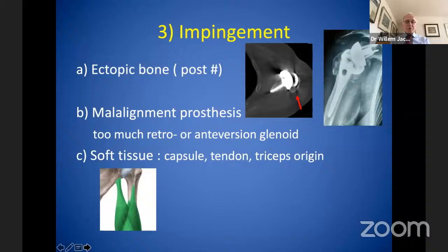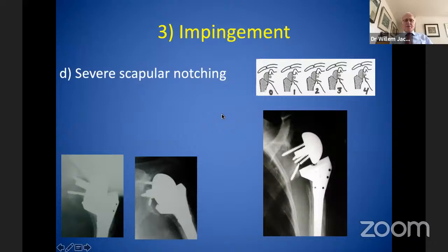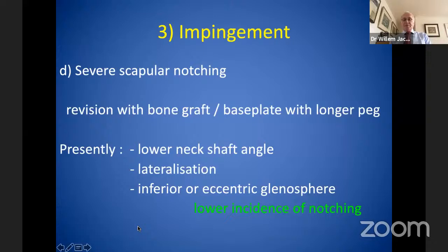Well, the fourth, of course the most frequent, is scapular notching. Grades 0, 1, and 2 hardly ever cause instability, but type 3 and type 4 can lead to severe notching like here, breakage of the screw, and impending instability. And then there's another case where there is a dislocation due to breakout due to this very severe notching inferiorly. That is an older Grammont type where we didn't pay that much attention to the inferior or eccentric placement. So generally you have to revise the glenoid with a bone graft or a base plate with a longer peg. But presently there's a lower incidence of notching thanks to the lower neck shaft angle, the lateralization, and the inferior or eccentric glenosphere.